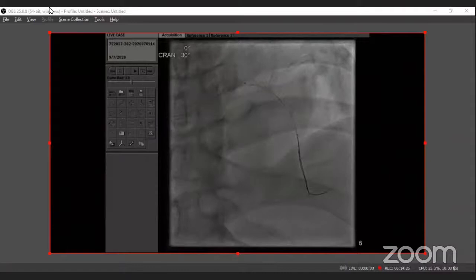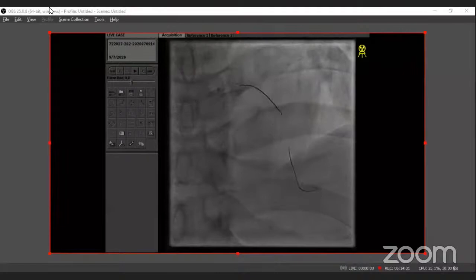So I have to be careful. Okay, just plug it here. So it should go in easily now, I hope. Not really. Okay. So inflate 3.0. 18. Okay, down.